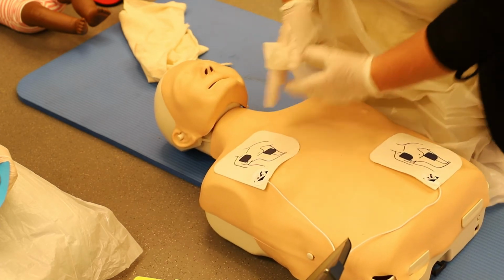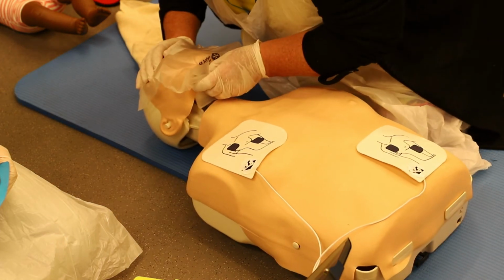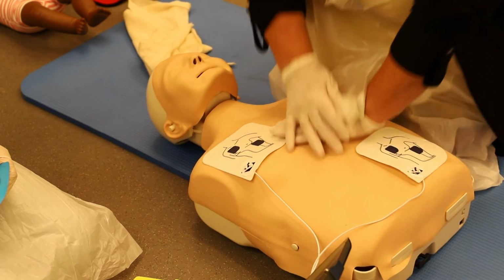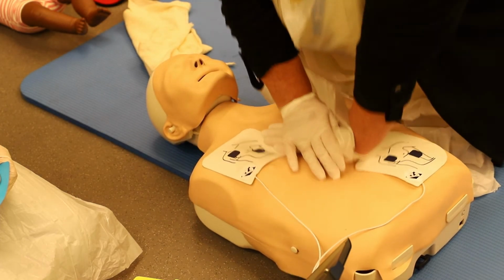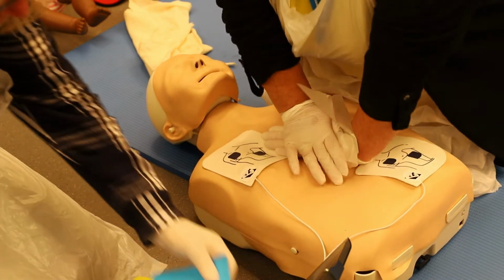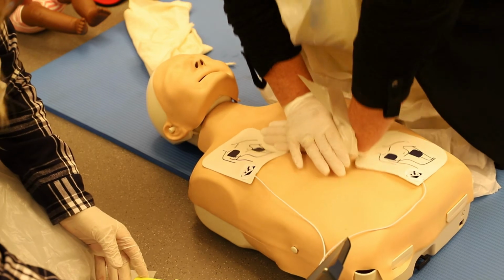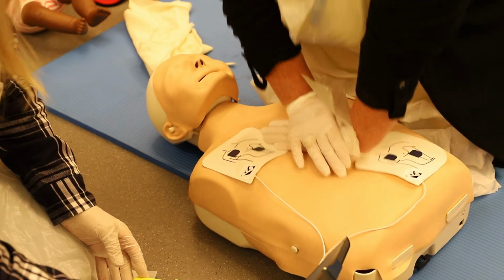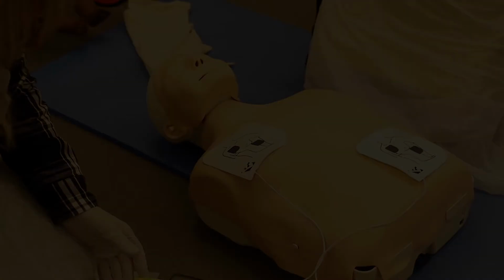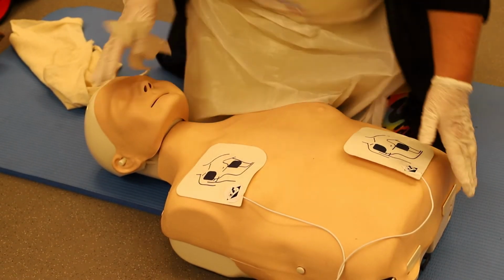Give breath. And then I will give my casualty 2 breaths, if I'm giving breaths, and then continue with my 30 compressions. We will continue this process until the machine tells us to do something different, or until the ambulance people arrive and take over from us. So we would continue the process and listen to what the machine tells us to do.